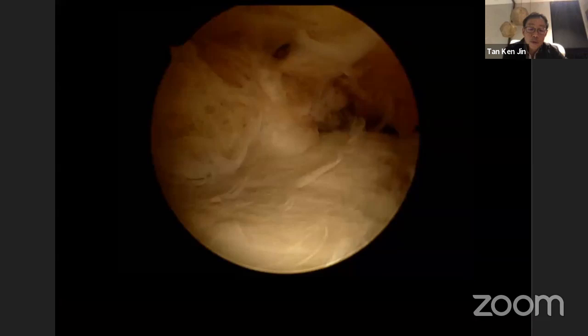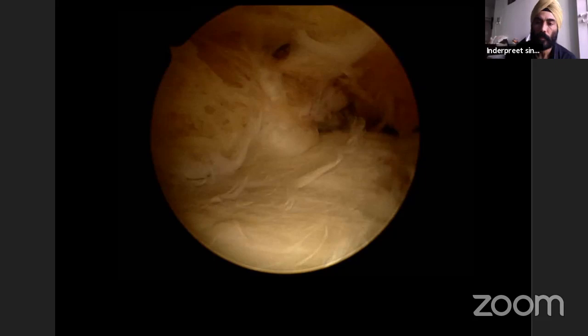Sometimes a patient with a chronic instability won't have a symptom of instability, but they have pain mainly because of the impingement in the gutter, or sometimes because of the anterior osteophytes impinging on the talar neck. So with the arthroscopy, if you can just clear the gutter and remove that small osteophyte, the patient will be far better. Yes, but you need to be sure that there is something which will help the patient.